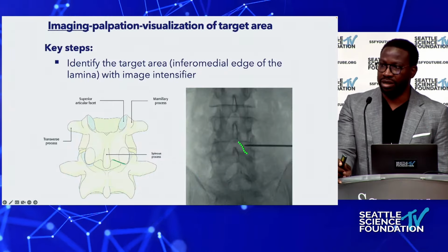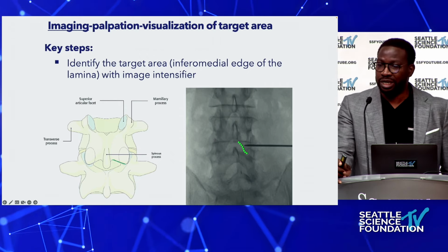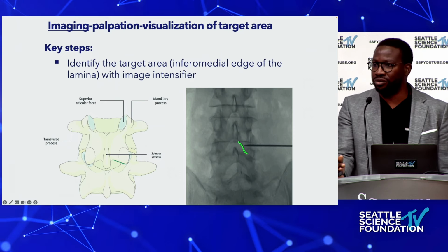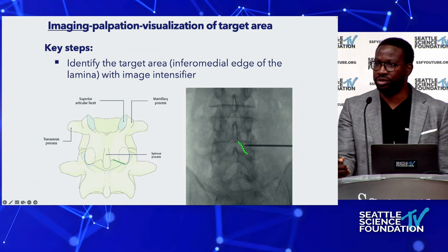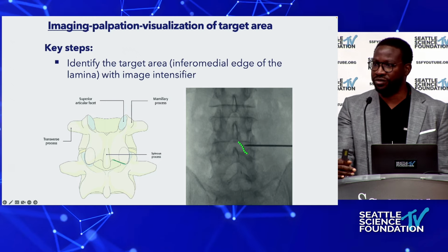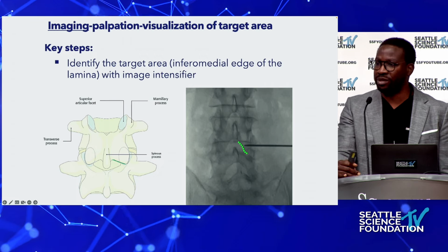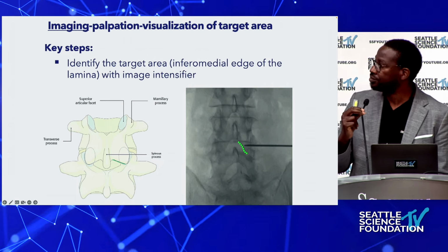And again, the whole purpose of endoscopic spine surgery is the least invasive approach. I think the one thing that we haven't really touched base on is that this doesn't limit other approaches. If you do the least invasive approach and it works for 1 year, 3 years, 6 months, however long it works, you save that person from having to have the more invasive surgery for that time frame. And if they need to go to that bigger surgery, you've at least given them the option of trying something less invasive first. And many patients are appreciative of that.